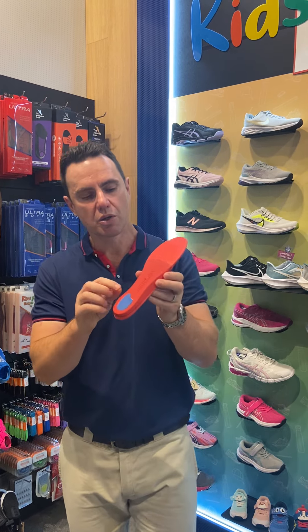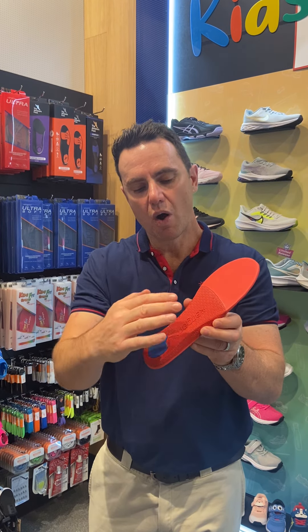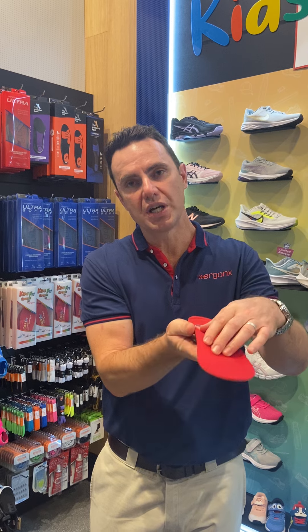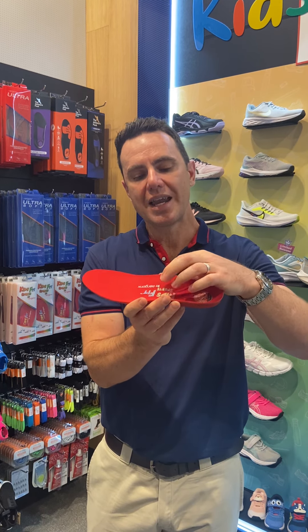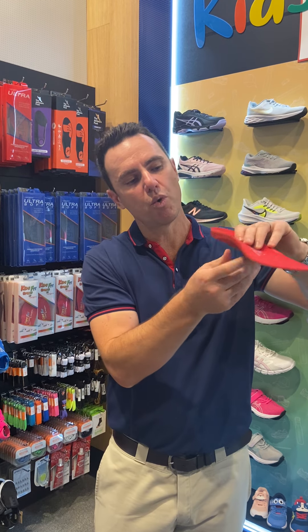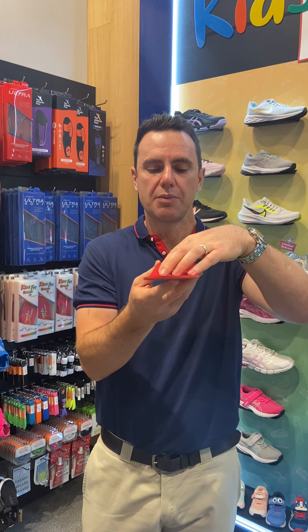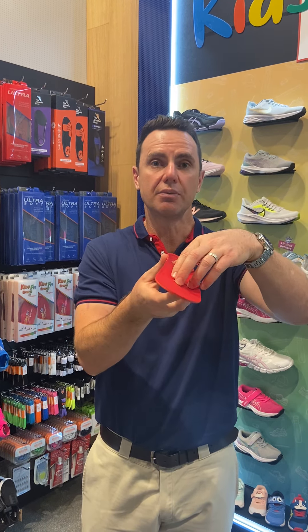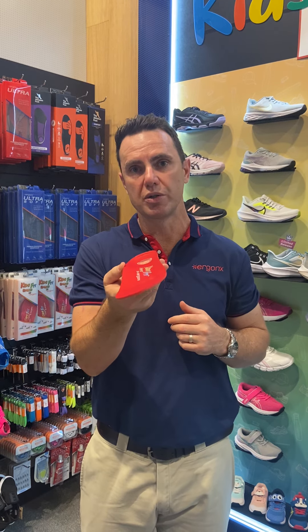The other thing the orthotic inner sole has got is this really nice, hard, supportive shell. On the outside we've got the hard supportive shell, and on the foot side we've got this EVA layer that's nice and soft. That helps to mould to the child's foot and feel nice and soft, but then we get the nice support from the hard outer shell, and this helps to keep the child's foot in a corrected position so they don't get aches and pains across the school day as their foot rolls in too much.